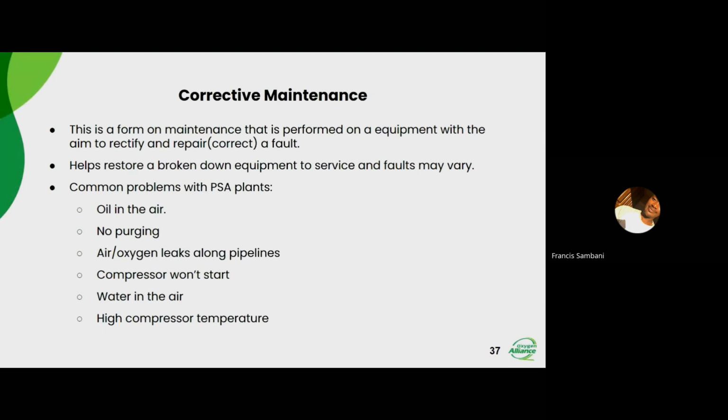Also, check if your eco drains are working as well, because the eco drains remove the condensate as well as oils. But you should make sure that you don't have oil. There should be minimal trace, close to zero amounts of oil in your condensate. And you shouldn't get any oil on the last two filters going to the AST. You shouldn't have oils there. If you have oils there, go back and find out why you might have oil in your system and try to get that sorted out. Moving on.